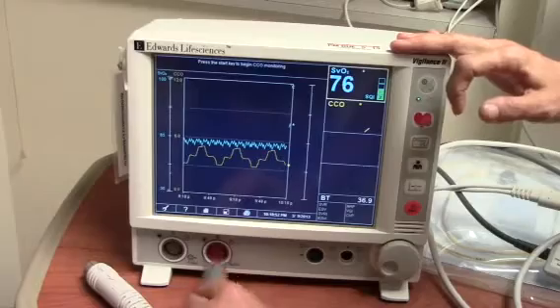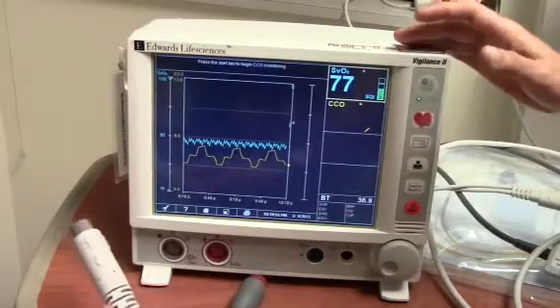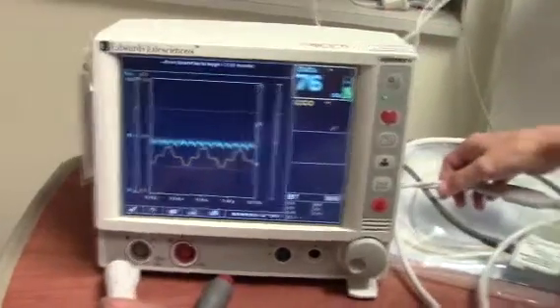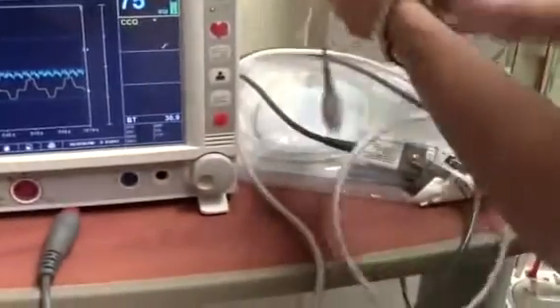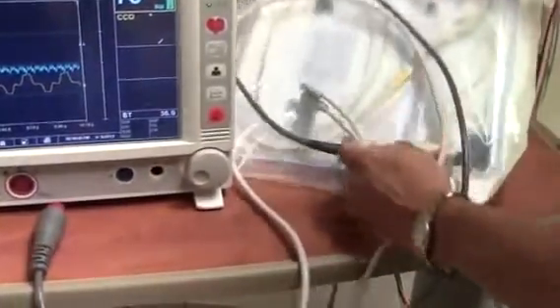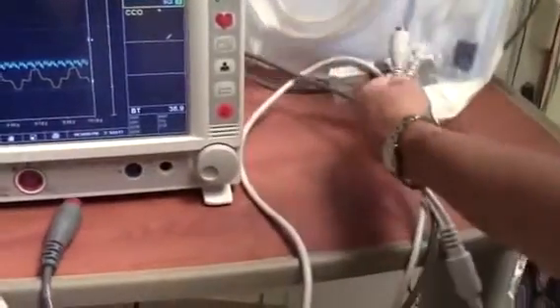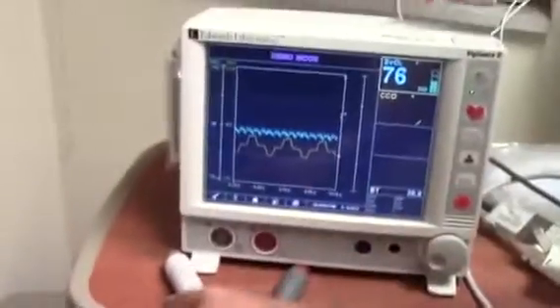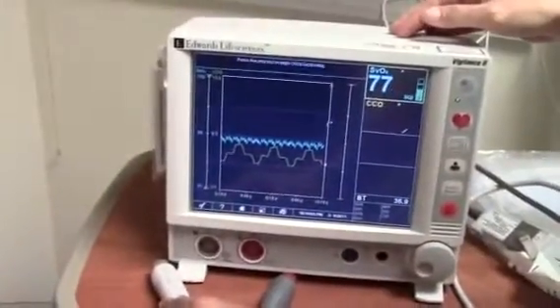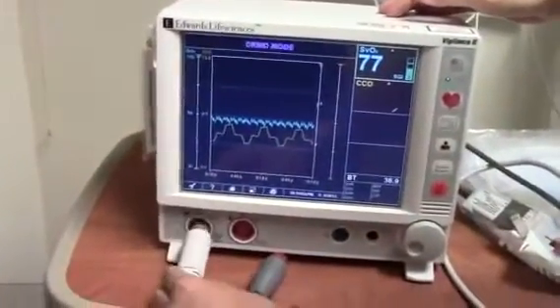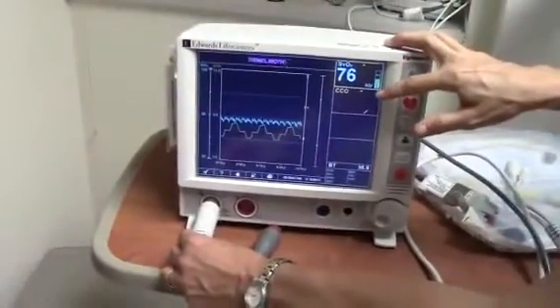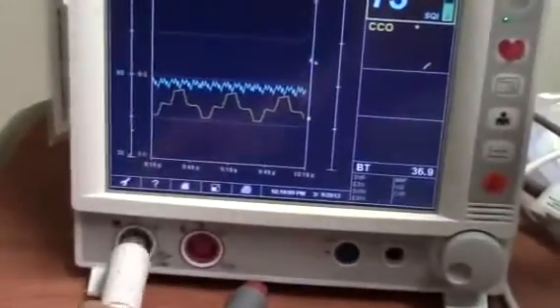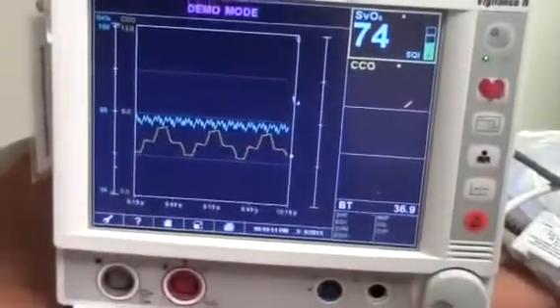The brown color cable is the continuous cardiac output cable, which you will need to connect to the continuous cardiac output catheter. The other end of the cable connects to the bottom left on the monitor. We will not connect it due to the monitor being in demo mode.